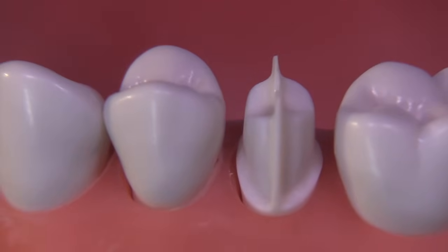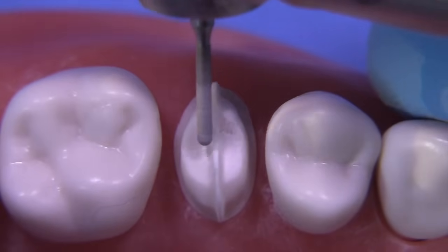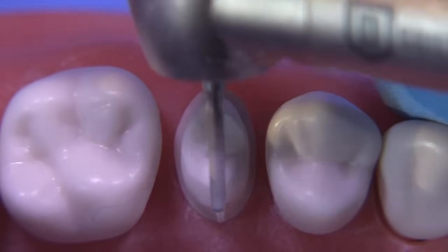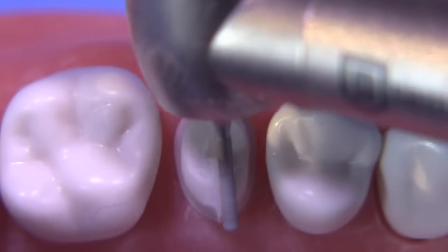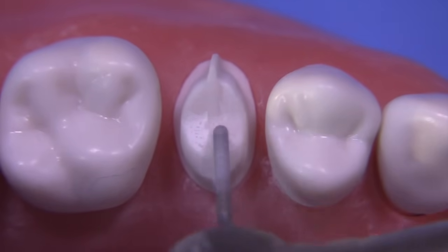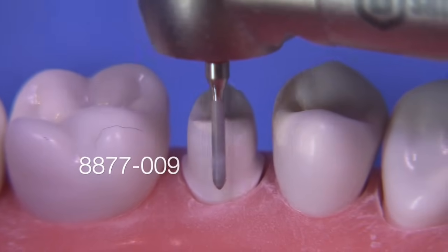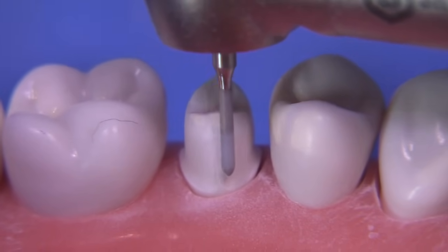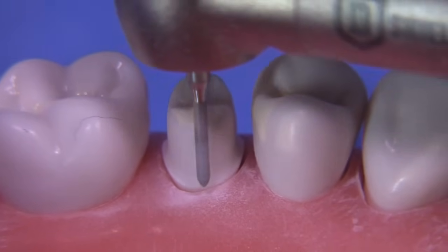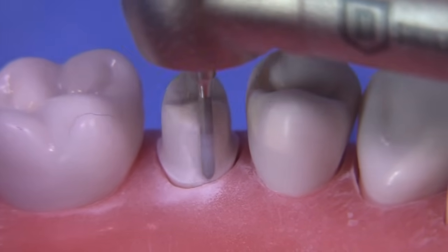Clinically, I think those dimensions are quite good. Now I'm going to utilize the KS0F here just to remove the tenon — it's served its purpose and we know we've reduced an adequate amount for the material we've designed for this case. Now it's just a matter of removing this little tenon from the occlusal, the facial, and the lingual — really easy to do. The 8877 009 is a terrific diamond for finessing gold finish lines and produces a beautiful chamfer, so since I'm removing the tenon on the lingual and want a chamfer there, I'll utilize this chamfer bur in that area.